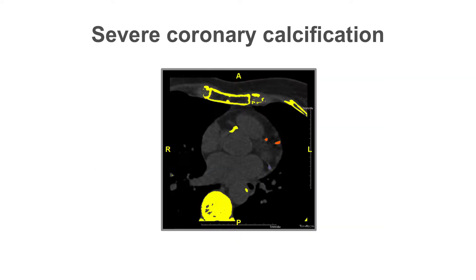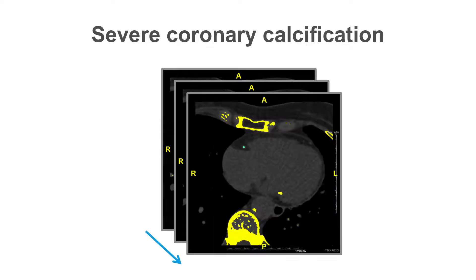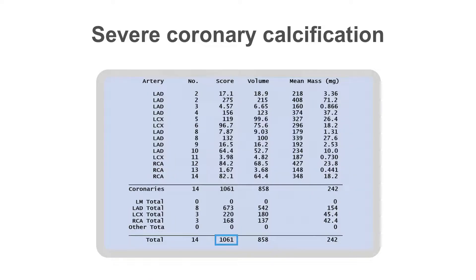Let us work through a case together. Using the same principle, this is an example with more extensive coronary artery calcification. The total coronary artery calcium in this case was 1,061 Agatston units.